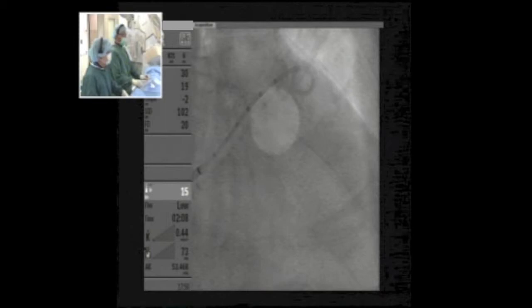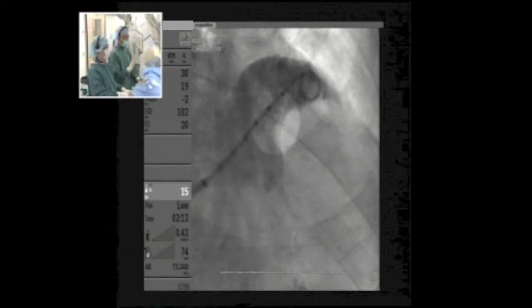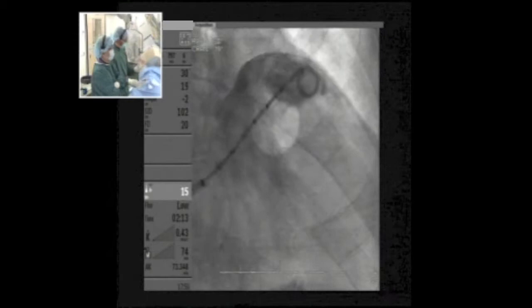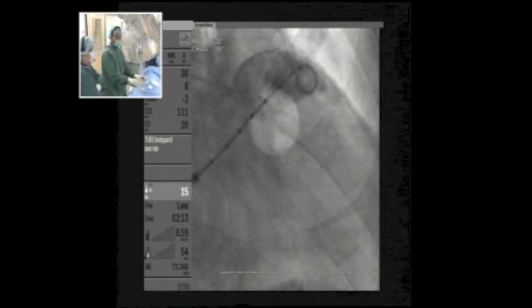We are now going to do an injection in the RAO cranial projection. In the RAO cranial view, we define better the proximal portion of the appendage — less well the distal part. To see the distal part better, I also like to do the RAO caudal view — typically caudal 20 degrees — which should help appreciate the distal portion better.